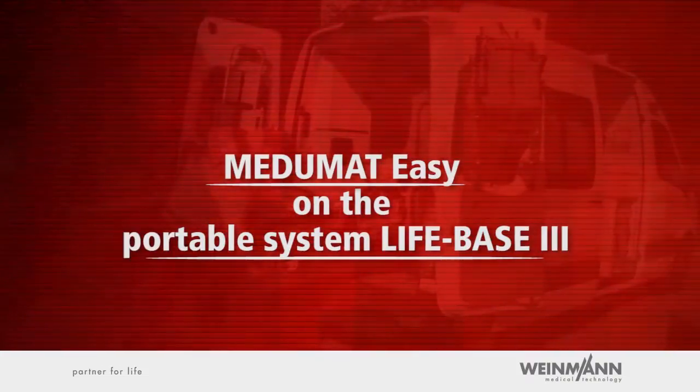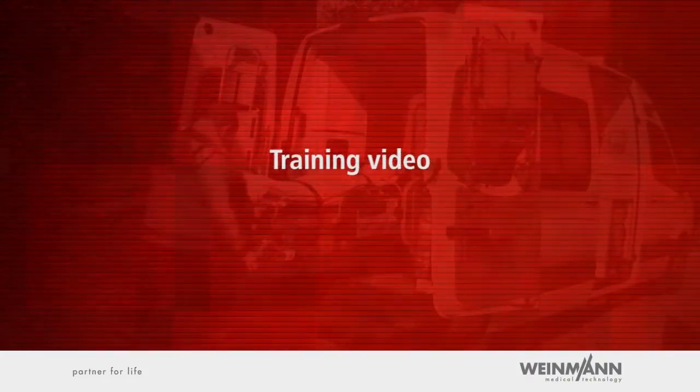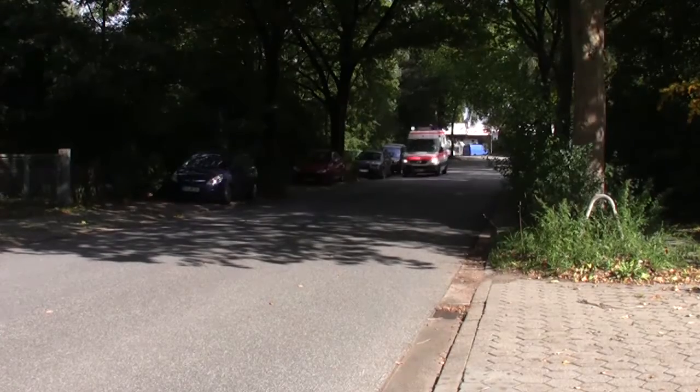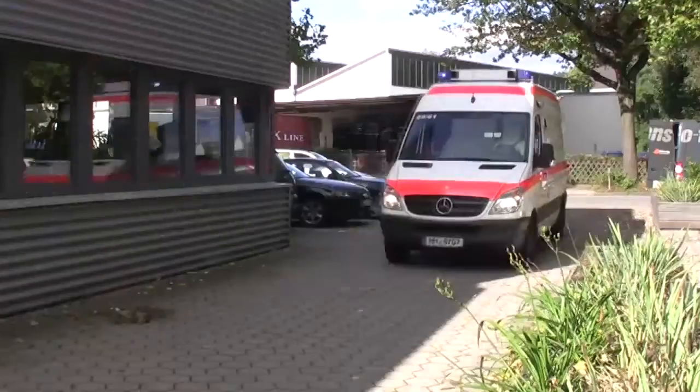Mejumat Easy on the Portable System LifeBase 3 — Training Video. In the following demonstration of Mejumat Easy and its LifeBase 3 Portable System, we will show you the ventilator's operation and major applications.